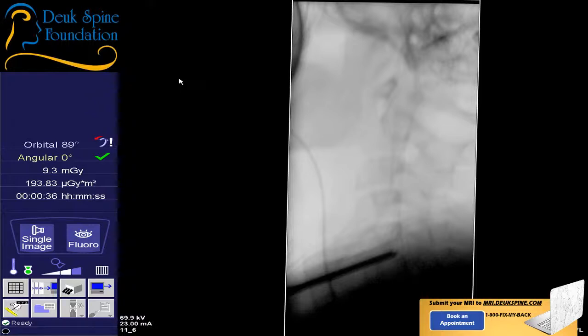Okay, now while they're doing that, take your time, guys. Make sure it's above her wrist so it doesn't pull her hand, that it gets above the joints. All right? And Jordan, you're not going to go crazy. You're just going to do a nice, firm, steady pull. Steady, easy pull. Summer, you can come. Do you mind just doing a fluoro shot? Give me a shoulder pull here, Luis.